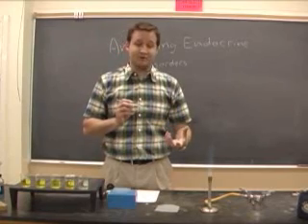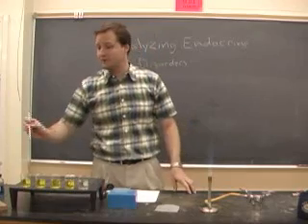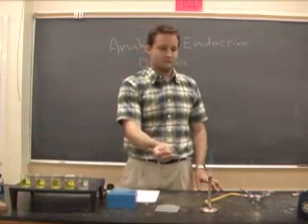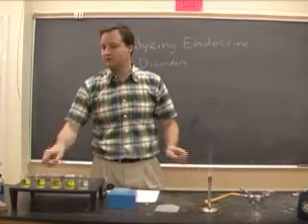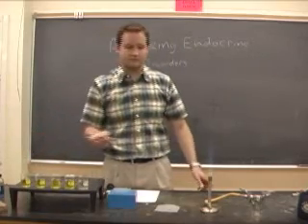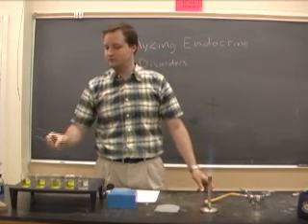Here, live, it appears orange. For whatever reason, on film, it looks red, as you'll see. We'll start with sample A. Okay, little flicker of orange, but for the most part, that stayed blue. Try sample B. Again, that one stayed blue.